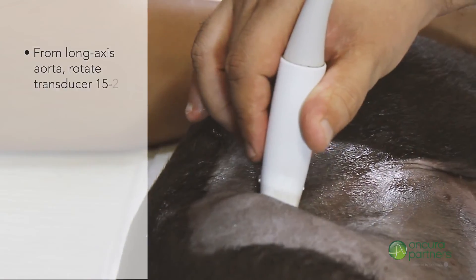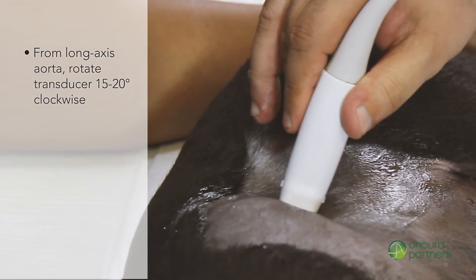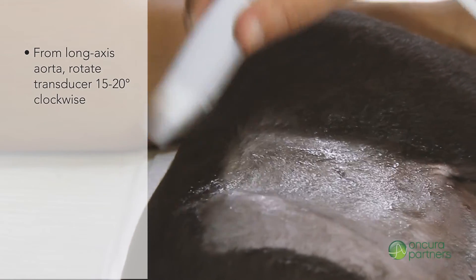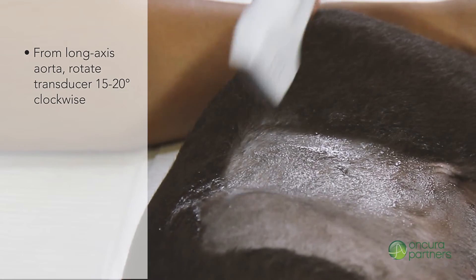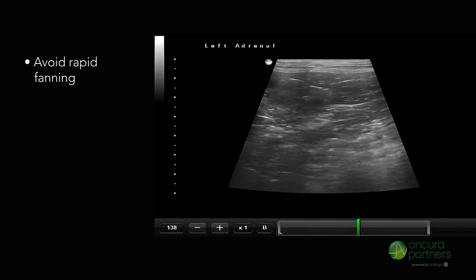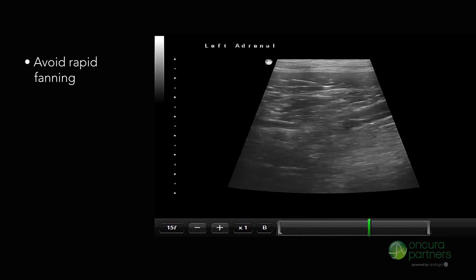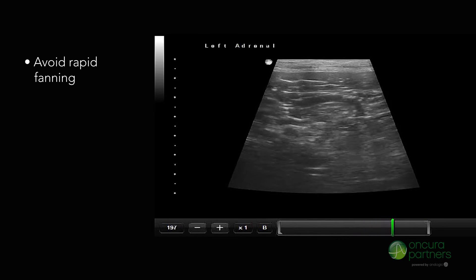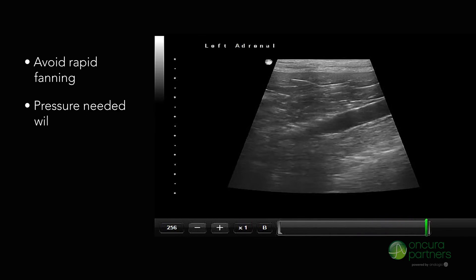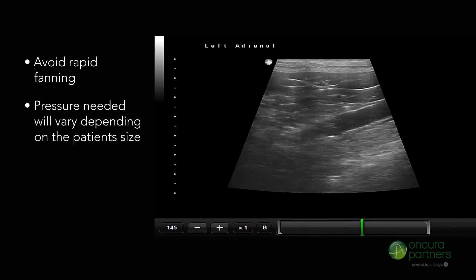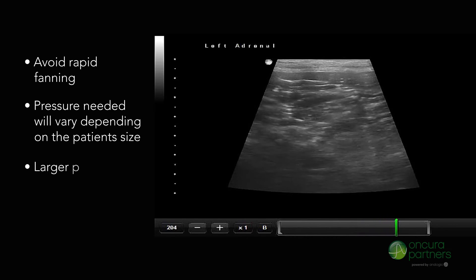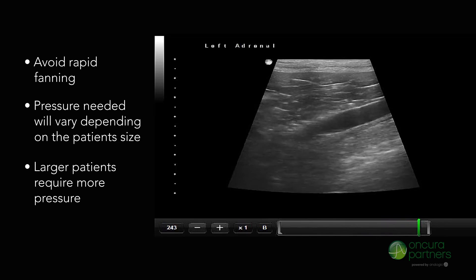From the long axis aorta, rotate the transducer 15 to 20 degrees clockwise and then begin fanning. Note that rapid fanning will make identification of this small organ very challenging. The amount of pressure needed will vary depending on the patient's size, with larger patients requiring slightly more pressure.